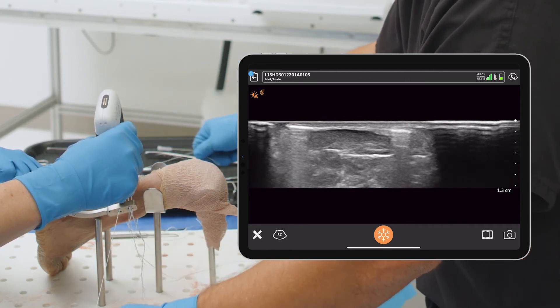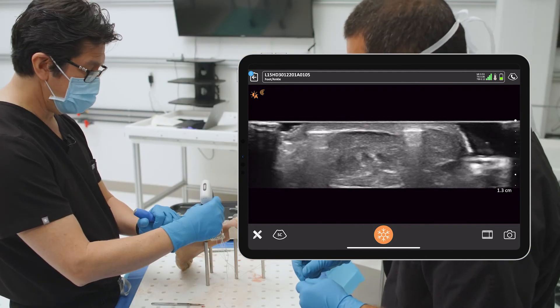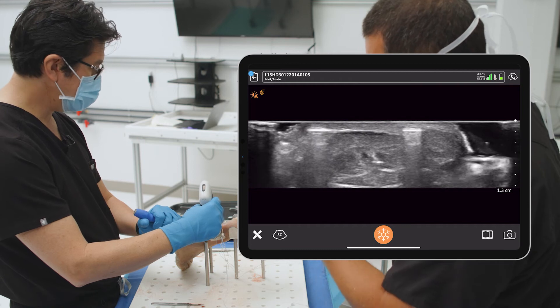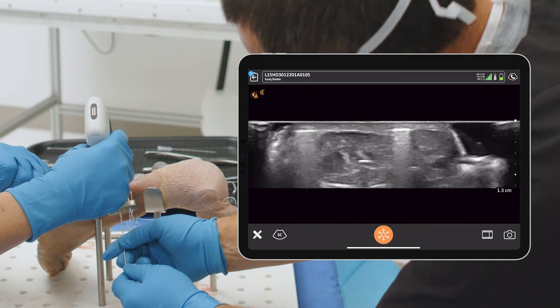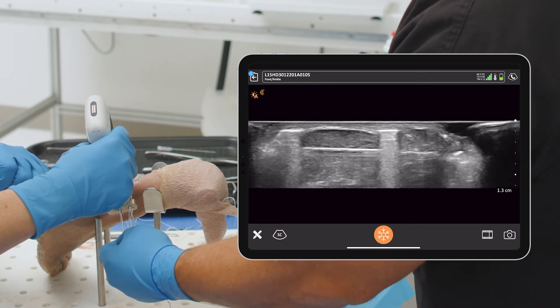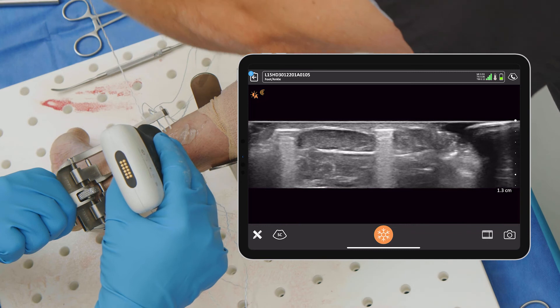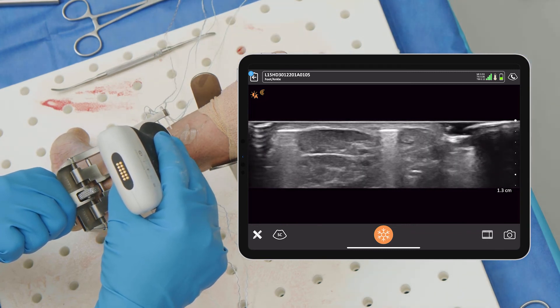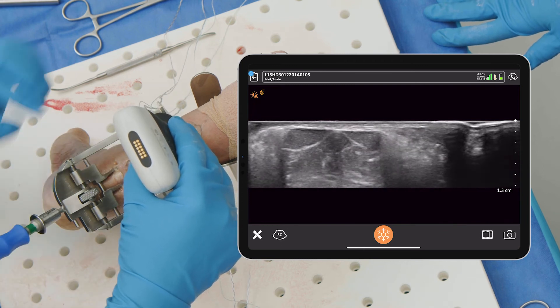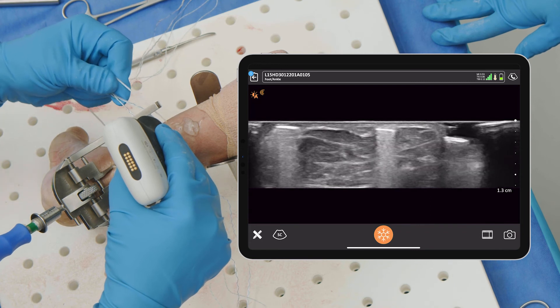This technique can use either five or seven sutures — five total with seven holes. Stop right there, let's just verify — and yes, once again dead middle. Good shot, Kelly. Go ahead and pass all the way through. If you want to redo these, say you made a mistake, it's no problem — you can just pull the suture out and redo it. As I scan through, you can see sutures one, two, three, four — you can see they're a little loose in the tendon because it's straightened out, but it's easy to see them and confirm you're happy with placement.